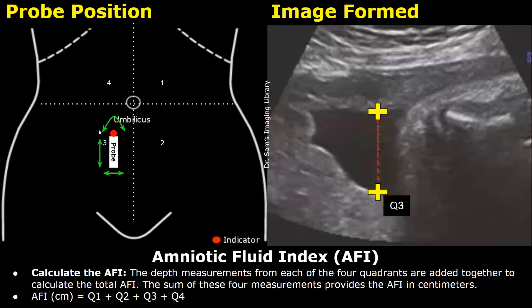Now move to the third quadrant, which is the right lower quadrant. You can move in a clockwise manner. Look for an amniotic fluid pocket and take the measurement in the third quadrant.